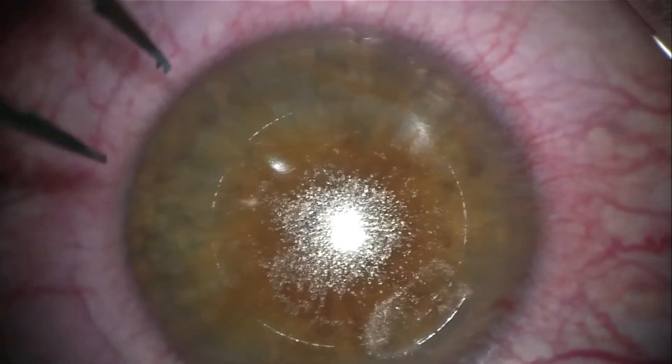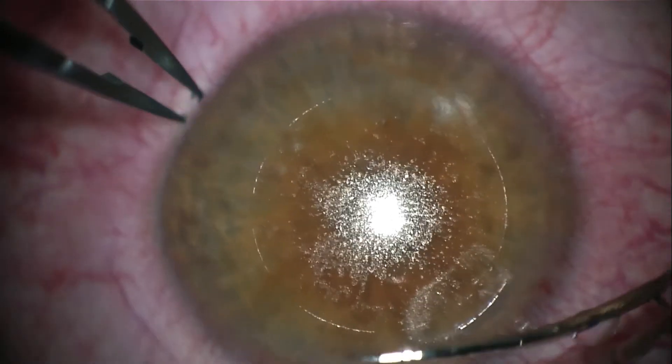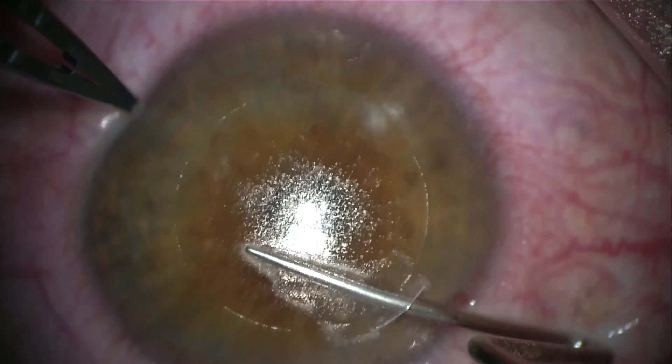There are different ways to do the dissection of the lenticule. Personally, I like to go in with the spatula and find the superior pocket that will bring the spatula above the lenticule. Then I go over the lenticule eccentrically, leaving one-third of the lenticule to the left of the spatula and two-thirds to the right. The reason for this is that one should always avoid going over the center of the cornea with the tip of the spatula, because if you are going to rupture the lenticule or damage the corneal stroma, it will most likely happen at the tip of your instrument.